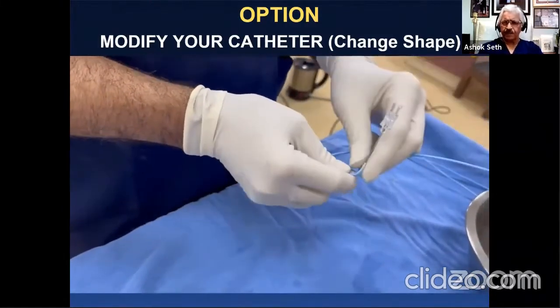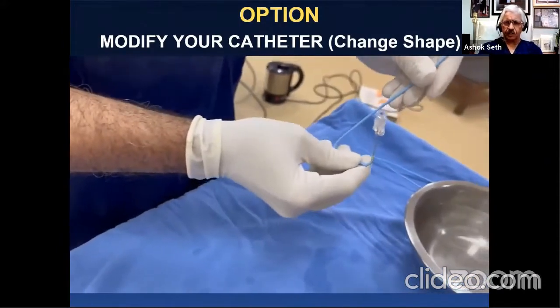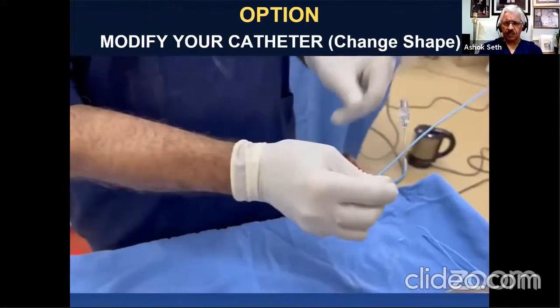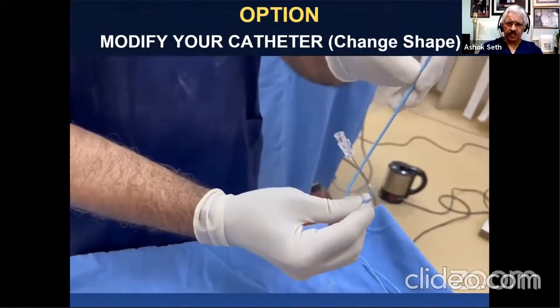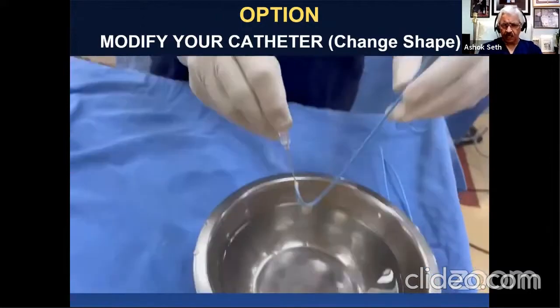So this would now fit into an anomalous right coronary artery. I believe that's the shape I should give it. It's pointing anteriorly, and so if it's going to lie in the left coronary sinus, it would be pointing anteriorly. I can do this for an Amplatz. I can do this for a Judkins.